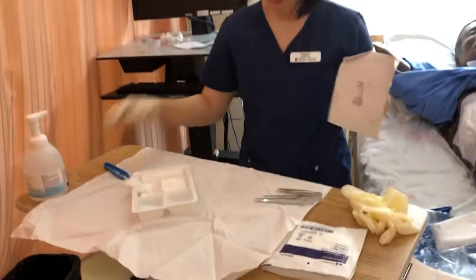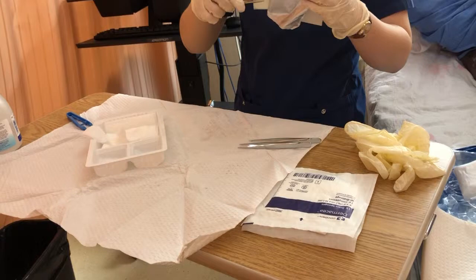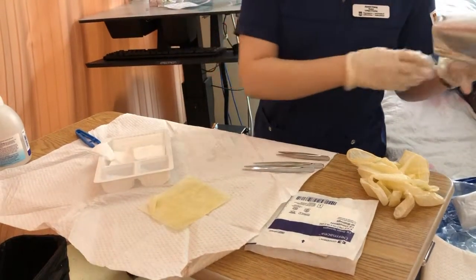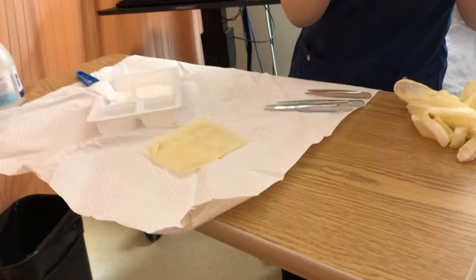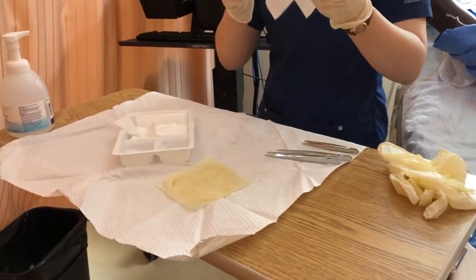And I'm also taking out my diluent. So I got the Medifix. And again, I'm gonna do hand hygiene and put on a new pair of gloves here. And my dressing sponge, I would ask the second nurse to bring me the Medifix, but it's a little busy on the floor.